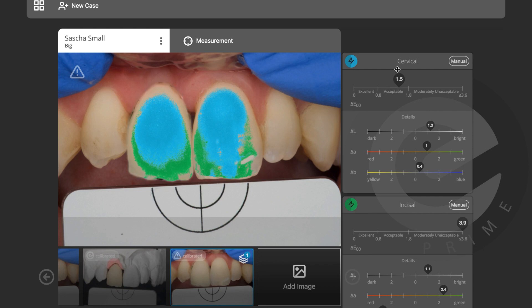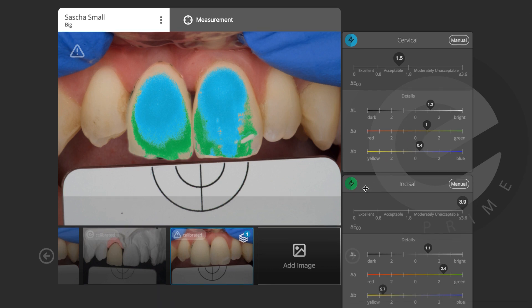The cervical delta E is 1.5. Looking at the graph: delta L is 1.3 — it's a little bit brighter than I want, which is actually fine at this stage. Delta A is a little bit greener.